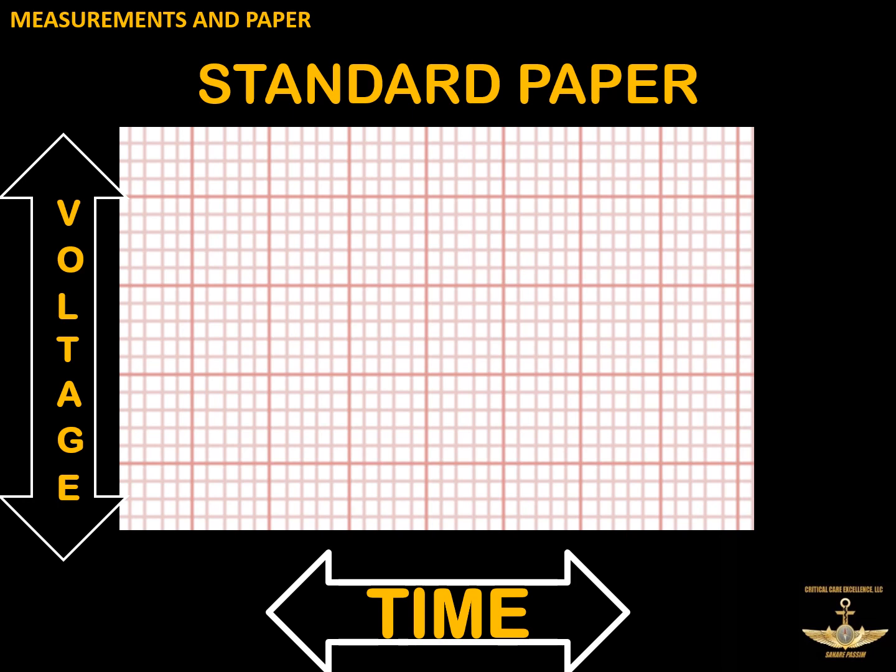So when we're counting somebody's heart rate, obviously it's beats per minute. It's a function of time. If you're looking at somebody's PR interval, that is the duration of the atrial conduction, a function of time. QRS duration is a function of time. And so we're really focused on how those things equate to time.